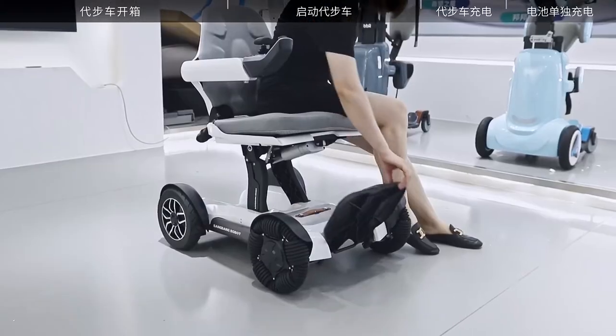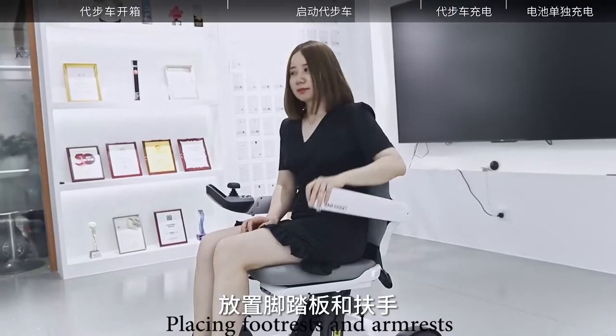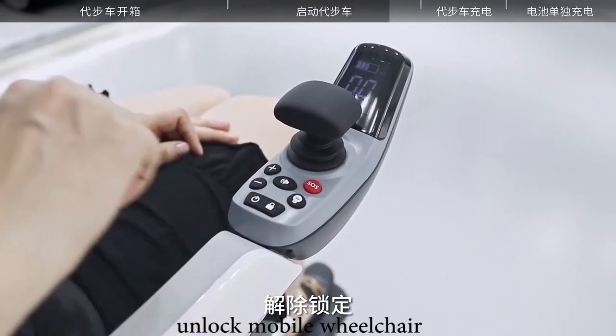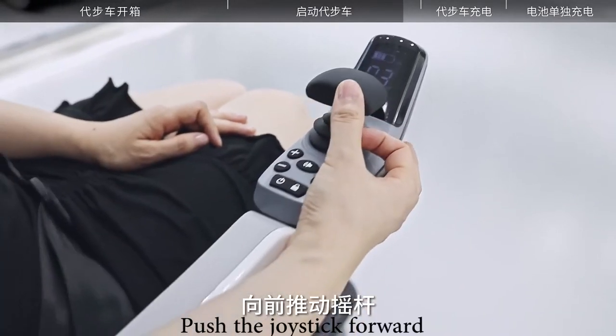Get in from the side. Place the footrests and armrests. Disconnect and buckle the seat belt. Unlock the mobile wheelchair and push the joystick forward.